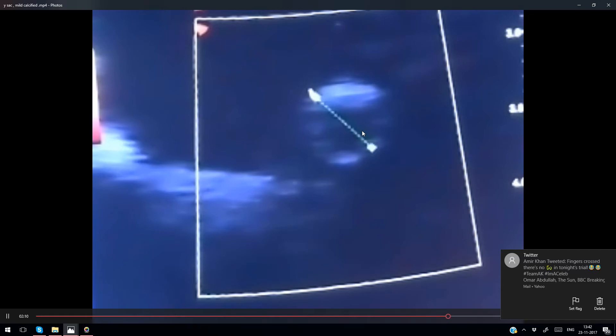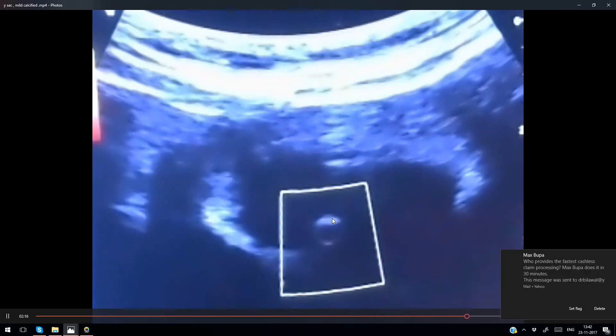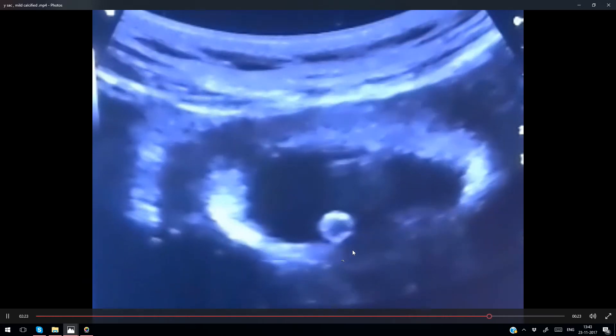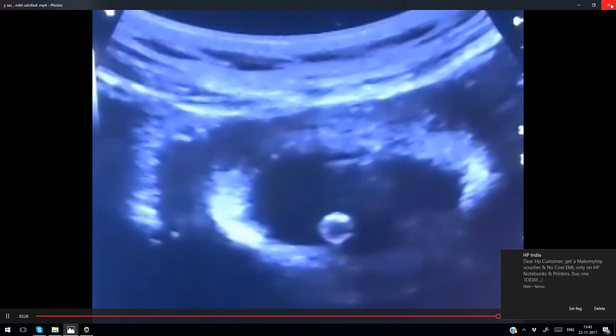I will put a color Doppler on it to see whether there is any venous congestion. If the wall takes flow, it means venous congestion is present. I am setting the color box on it, adjusting the PRF and gain. I am seeing that some areas are taking color — not completely, but some areas. Even if the yolk sac size is normal, this calcified wall is alerting me that I have to follow this patient.